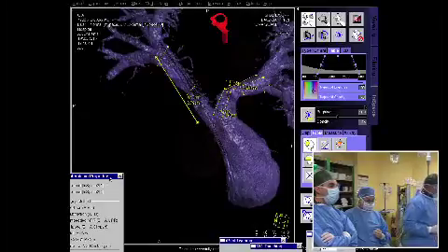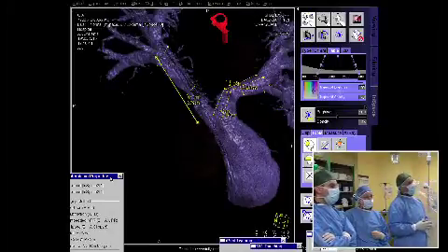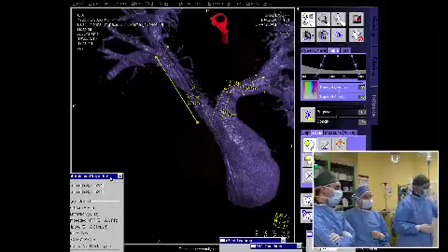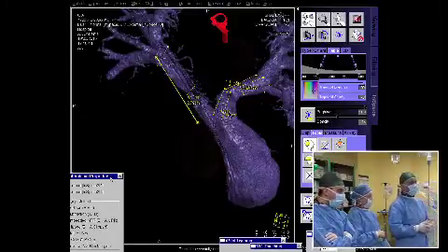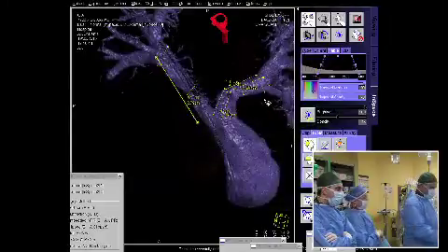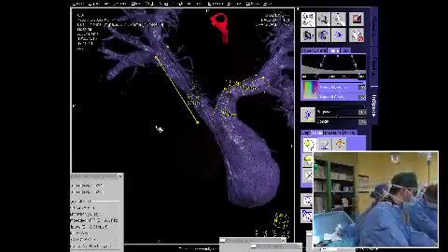So my plan is to implant 2 Valeo stents, 8 millimeters in diameter and 26 in length, that may go through a 6 French Mullins sheath, with the technique of kissing implantation, using the 3D rotational angiography as a roadmap to implant these stents. Gianfranco, do you agree? Did you place 2 sheaths in the two branches already? Yeah, we have the 2 sheaths and 2 wires and 2 everything. We just have to implant the 2 stents if all people agree in the audience.